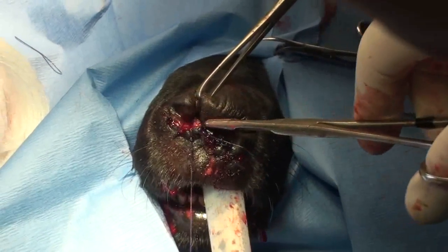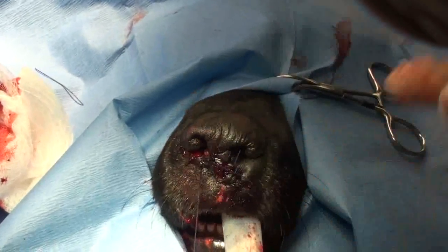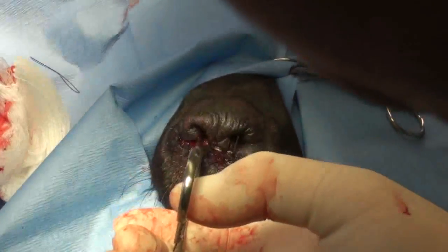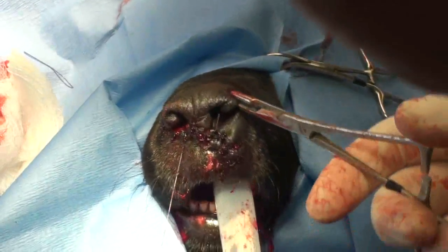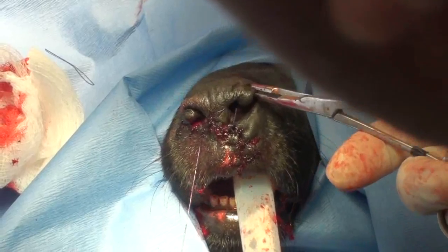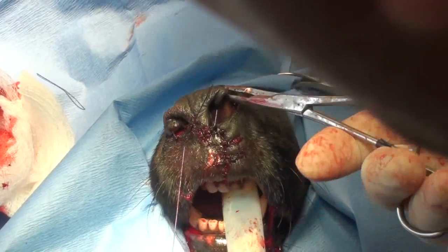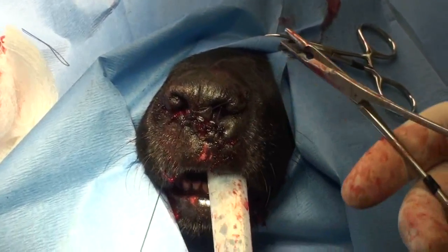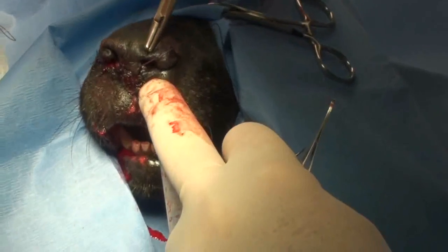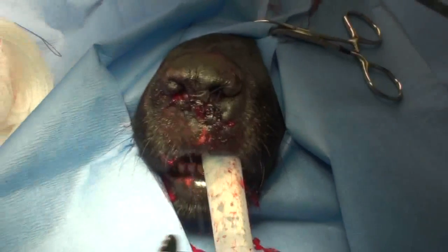This will now heal up pretty good. There's the air hole that goes into the nostril. Dog's nose — that's the nostril and that's the air hole. It goes in like that. These are the slits that dogs use: when they smell on the ground, they exhale and they can close the front and shoot the air out the side so they don't disturb the scent. Isn't that a neat adaptation? I just learned about that the other day. So a dog breathes in the scent, and then when it breathes out, it can close the nostril and open the side and shoot it out that way so it doesn't disturb the scent.